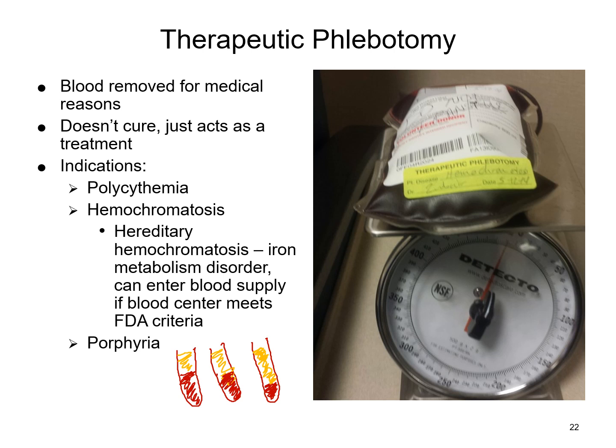Another thing I like to look for is if the plasma is really faded compared to what I'm normally seeing, so it's almost clear with just a yellow tinge to it. That leads me to believe there's possible contamination and starts throwing up some flags that I might need to investigate if there is some IV type of contamination going on.